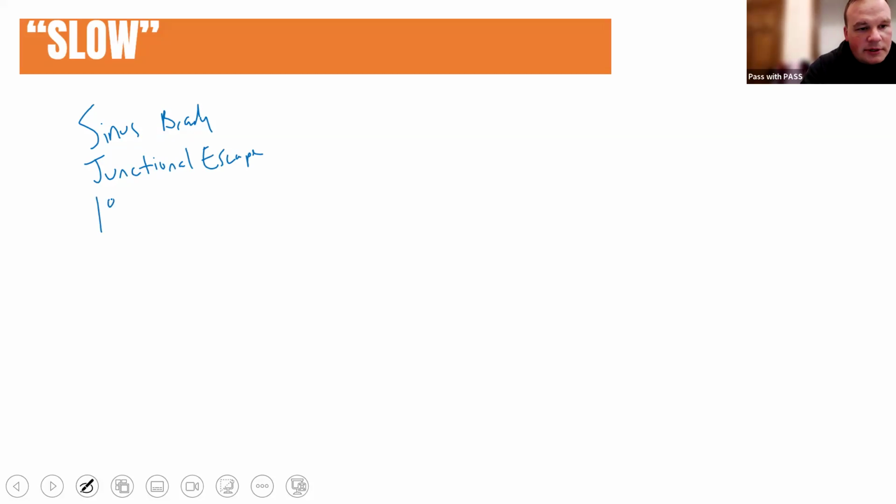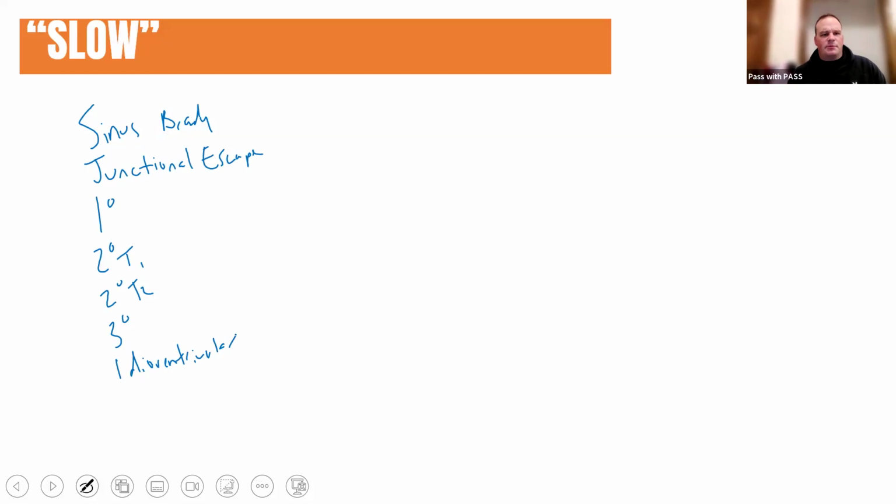So we have first degree, which we'll talk about, second degree type 1, second degree type 2, third degree. You can also throw idioventricular in there. So we have sinus brady, junctional escape, first degree, second degree type 1, second degree type 2, third degree, and idioventricular. Did I leave anything out there? Did I leave any type of bradycardic rhythm out?